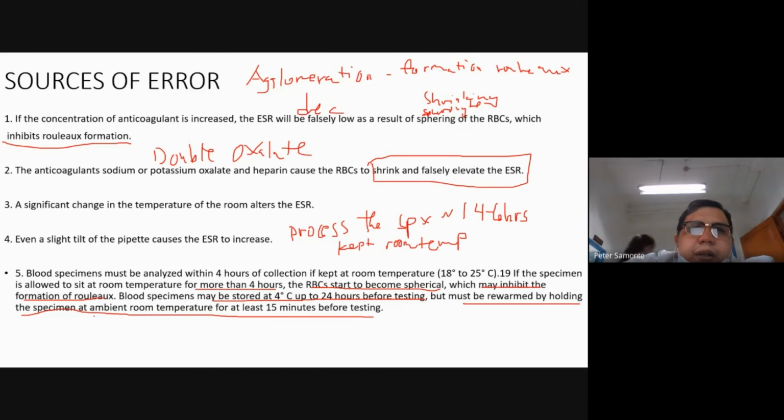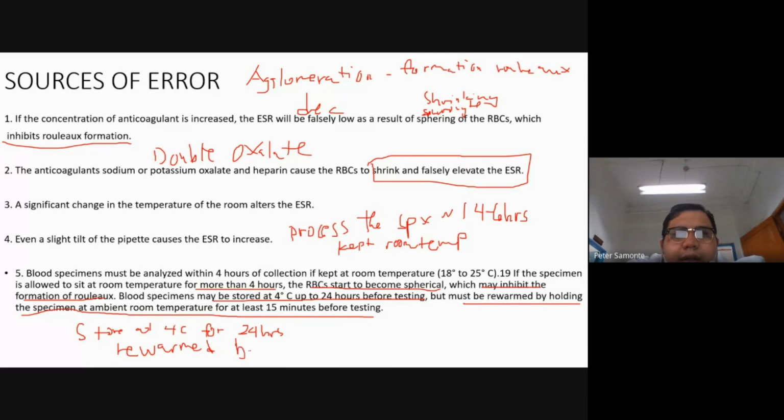Tapos, you need to store them at 4 degrees centigrade for 24 hours if hindi kayo makapag-test agad-agad. Then, it must be rewarmed. Kailangan nyo munang ibalik sa room temperature yung specimen before testing.